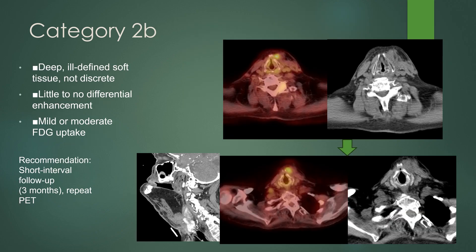Category 2B would be deep, ill-defined soft tissue — not a discrete mass — with little to no differential enhancement and mild or moderate FDG uptake. In this case, the patient post-surgery had a floor-of-mouth flap in place with extensive surgery in the neck. On PET, there's an area of abnormal uptake at the level of the thyroid cartilage superficial to it. On CT, you can see some soft tissue thickening but no mass-like enhancement, just some distortion of the architecture.